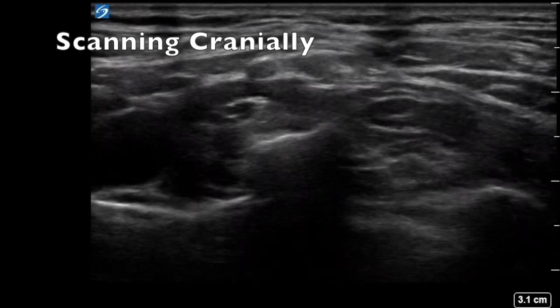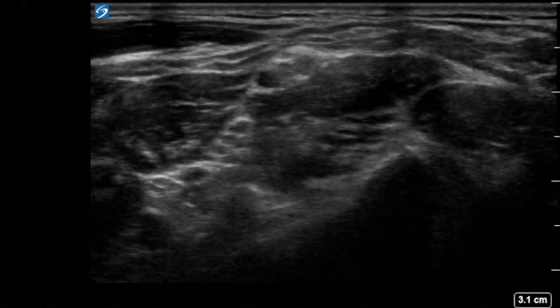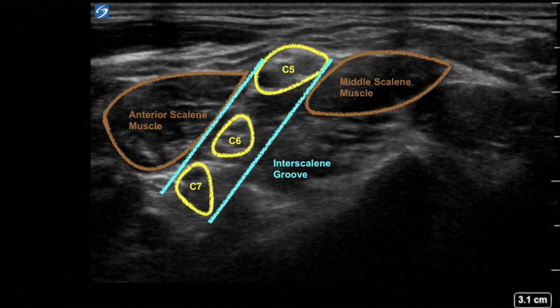Scanning cranially, you come to the interscalene view, where you can see the C5, C6, and C7 nerve roots sandwiched between the anterior and middle scalene muscles.